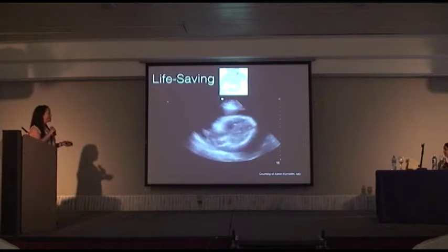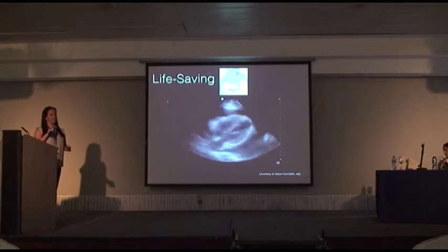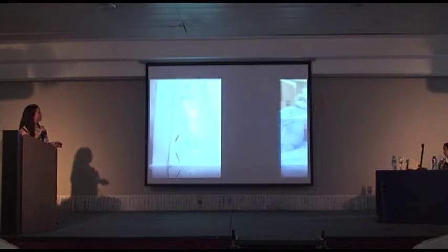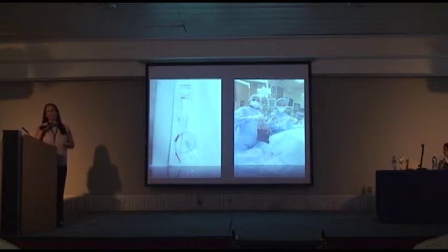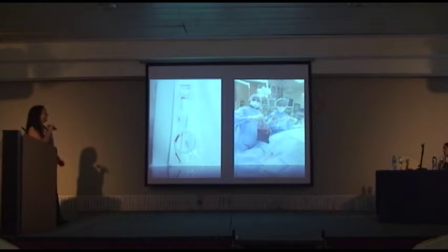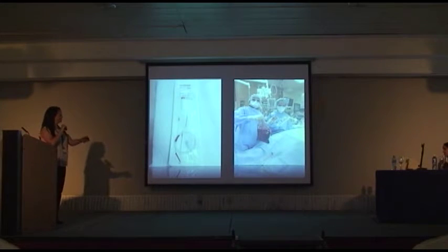That's not normal. So this child actually was in tamponade. This was not respiratory etiology, it was tamponade. He called the cardiologist, and they pulled off 1.5 liters of blood from around the heart. So my fellow saved this kid's life. So that was definitely a shining moment for ultrasound.